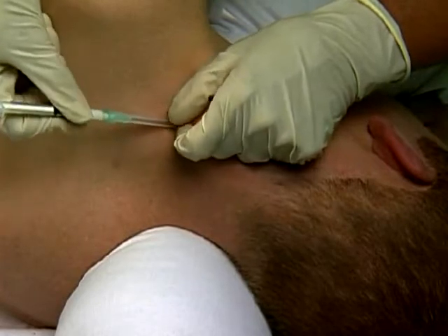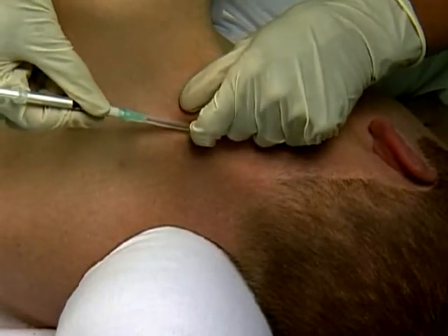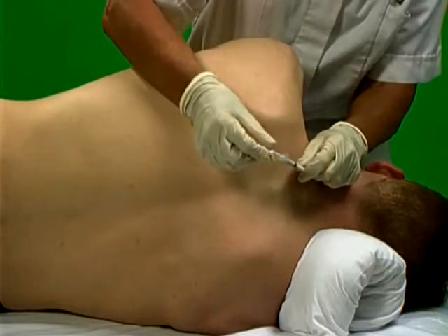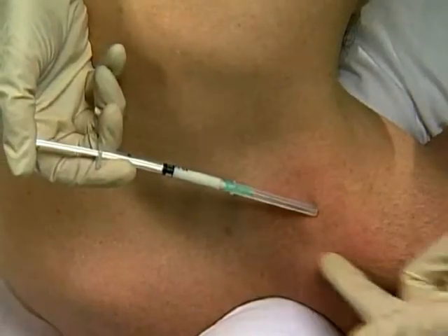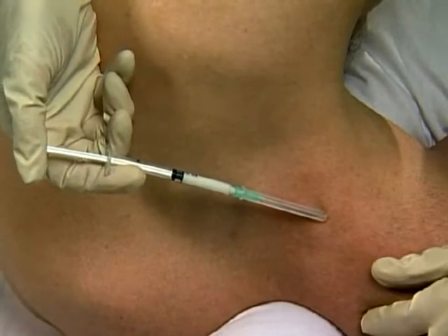Angle slowly proximally at about 30 degrees. Once needle tip gently touches bone of the facet, aspirate and inject in or around the joint as a bolus. Keep the needle parallel to the spinous processes at all times and do not angle medially.